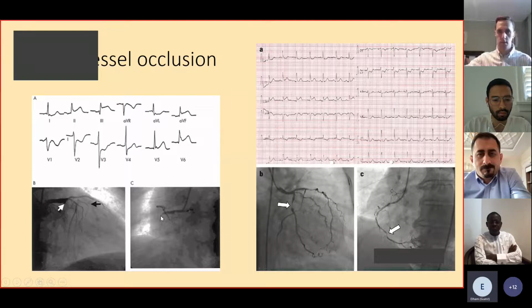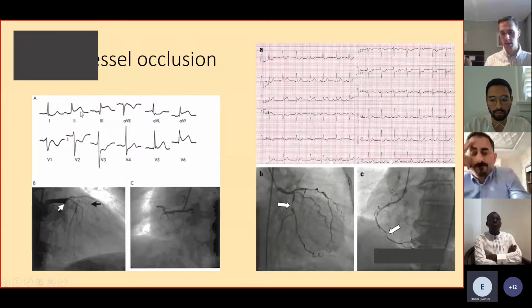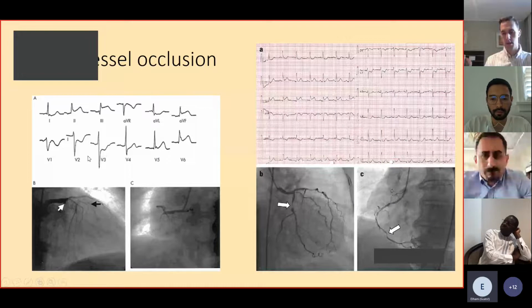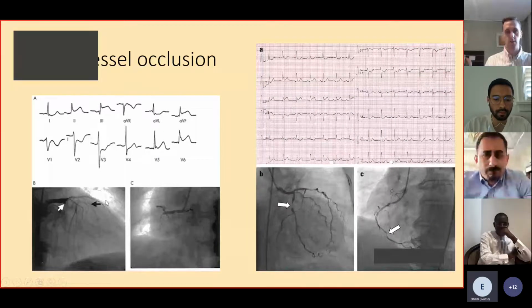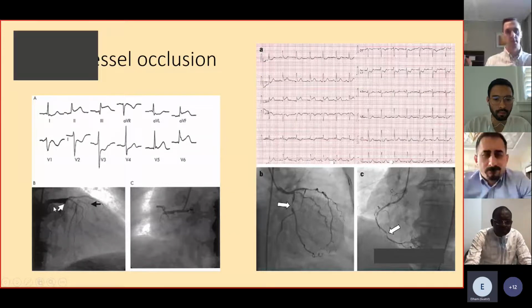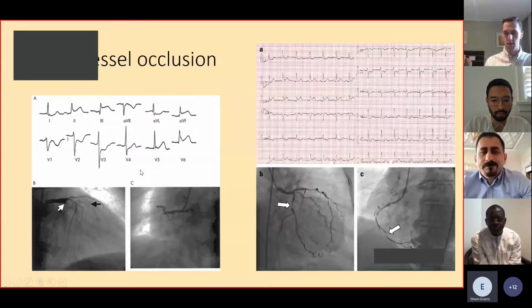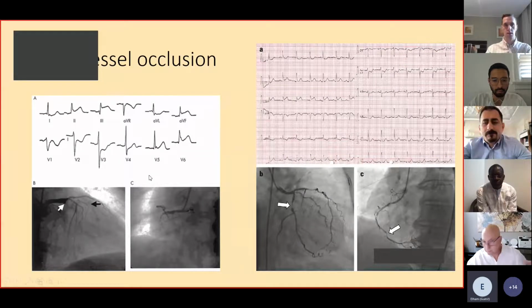But in this other patient, we have an occlusion of the left anterior descending artery with some faint collaterals, and also an occlusion of the right coronary artery. We have evidence of inferior MI, with ST elevation in lead 3 more than lead 2, and maybe evidence of right-sided infarcts, which we can't say because we don't have the right-sided precordial leads. But we don't have ST elevation in the anterior precordial leads. We just have significant ST depressions in V1 to V3, which may be due to a chronic occlusion of the left anterior descending with some faint collaterals, or maybe a cancellation of multiple currents of injury caused by a very extensive infarct in the inferior, posterior, anterior and lateral walls.